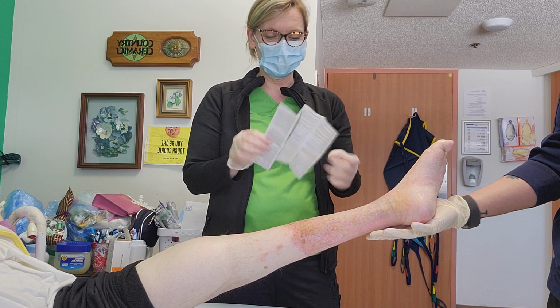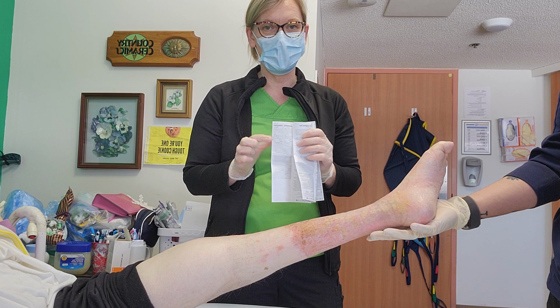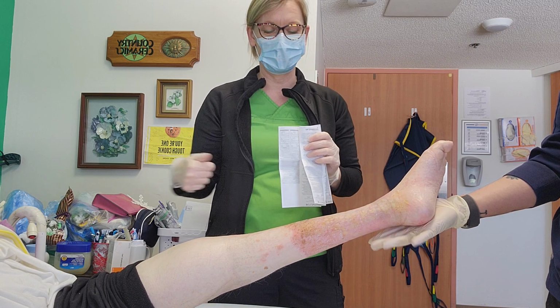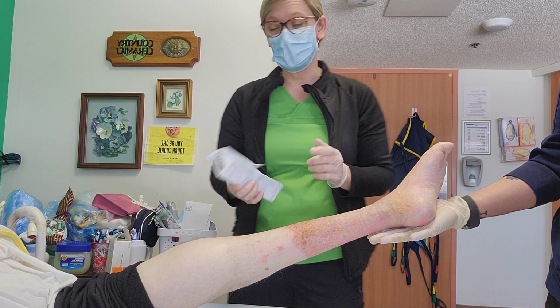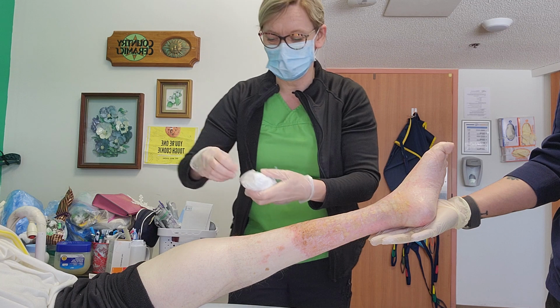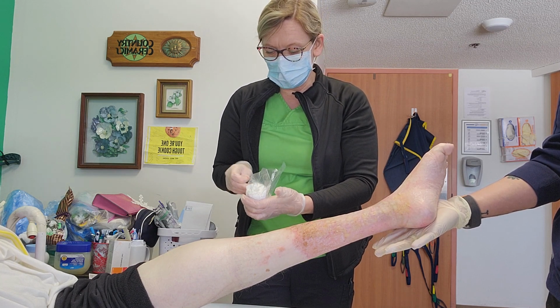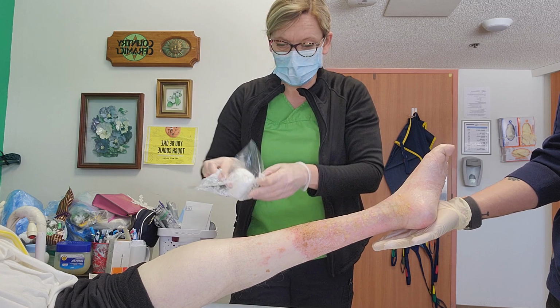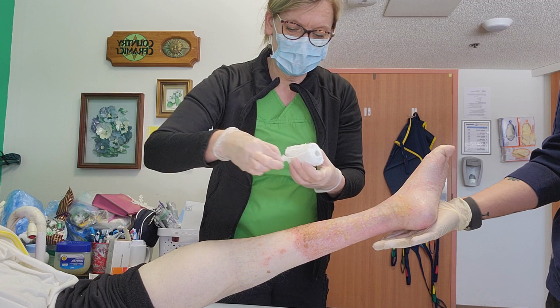I get out the instructions just to be specific because inside there's actually two methods. There's method 1, which is a spiral wrap that goes all the way up the leg, and then method 2, which is a C-shaped pattern, which is what I want to demonstrate today. So we have cleaned all of her leg off. We just use a face cloth with some warm water. That gets rid of the remaining Viscopaste. We don't really have to scrub it. And then, as with all compression, we start at the 5th toe.